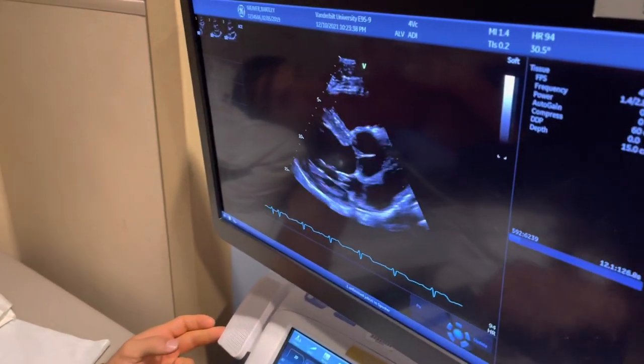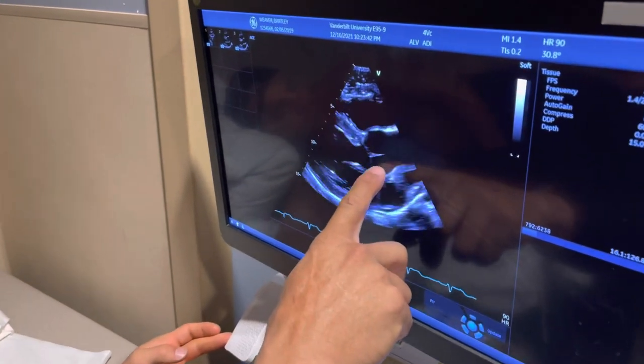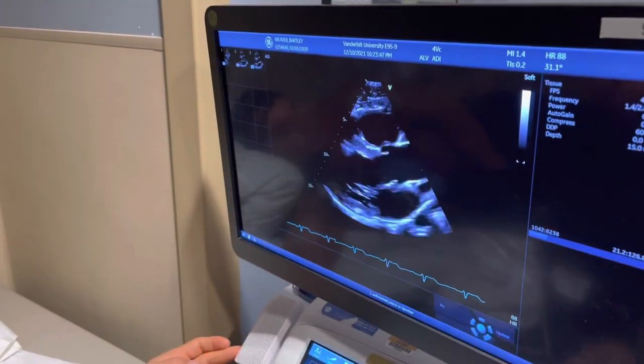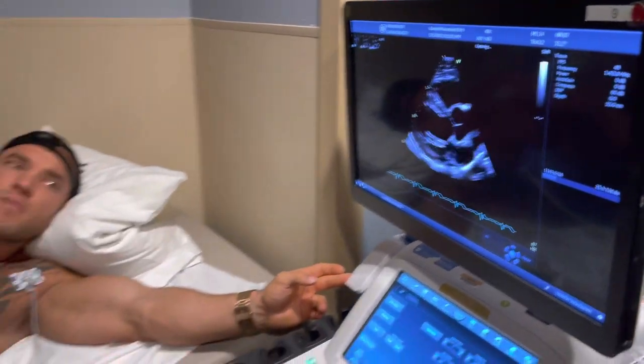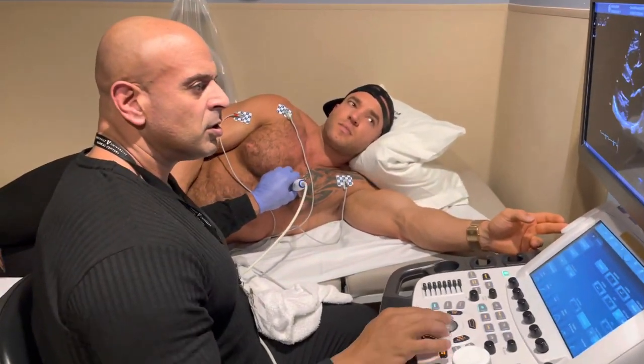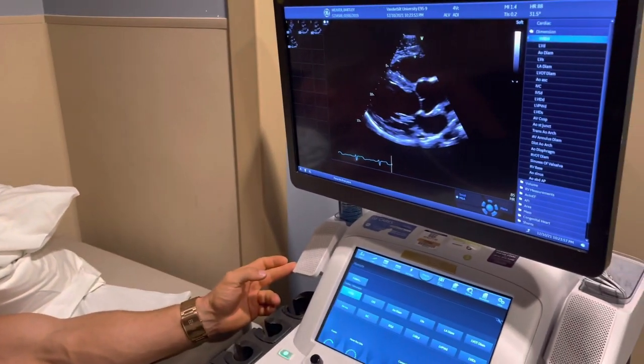On this view it's a cut from the inside, so we're looking at the mitral valve, aortic valve, part of his left ventricle, aorta, and left atrium — that's our receiving chamber. We can see the squeeze of the left ventricle. Perfect. Now I'm going to do some measurements here.